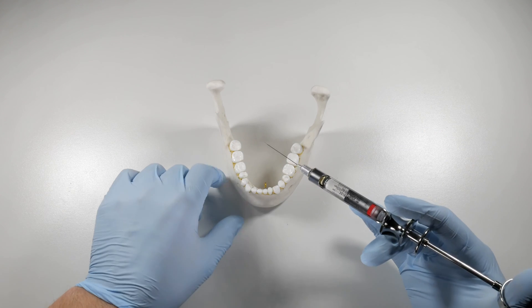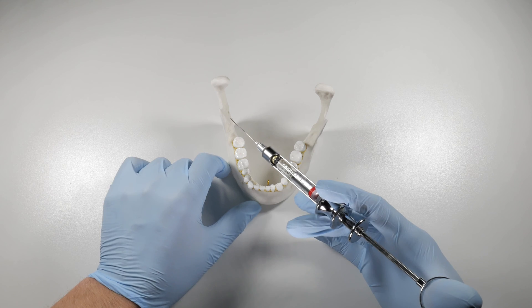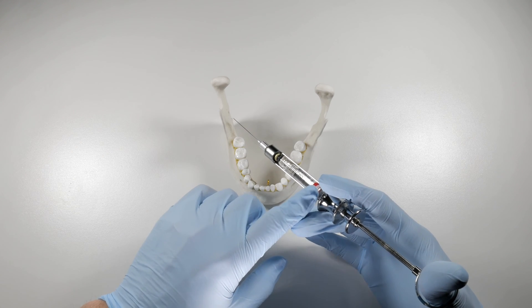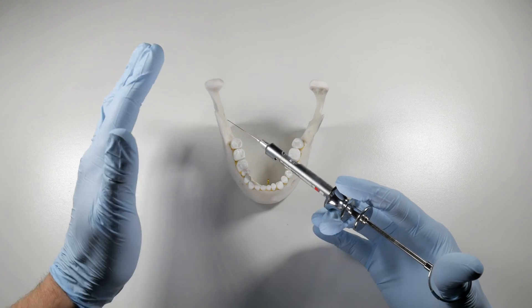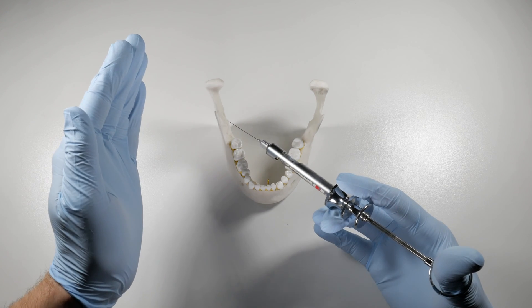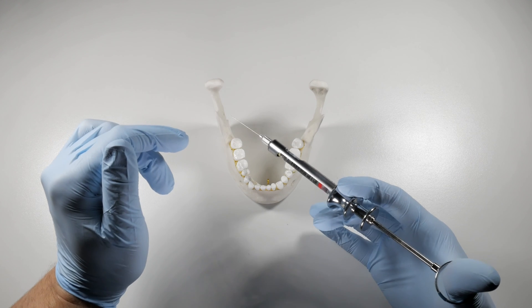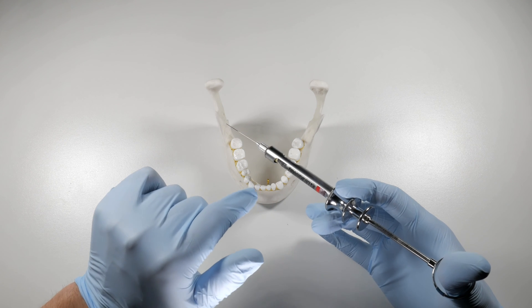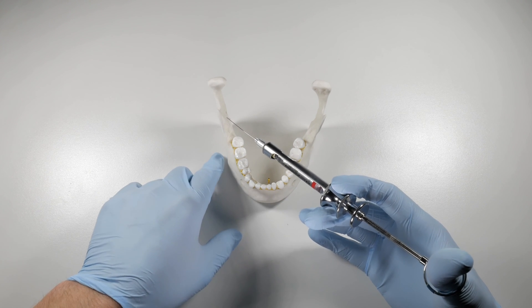The way that we avoid this is to go in, contact bone, and aspirate. If it's negative, chances are we're not in a vessel. Then what we're going to do is rotate our syringe slightly — it doesn't matter how much — but you want to move the bevel of that needle off the vessel wall if it is potentially against there, and aspirate a second time. When you do that, if it's negative, odds are good that you are not in a vessel, so you can deposit your anesthetic.